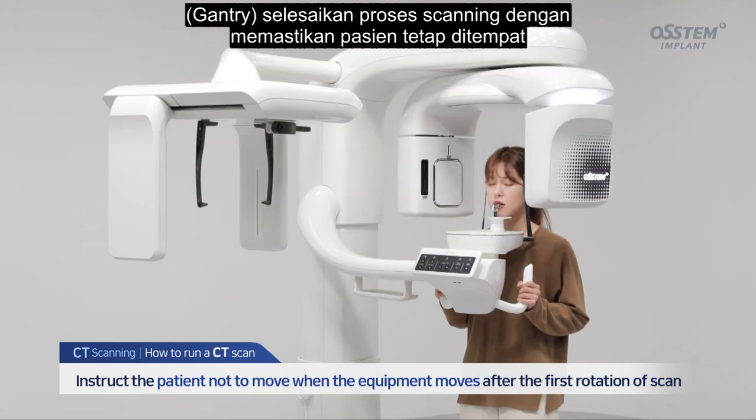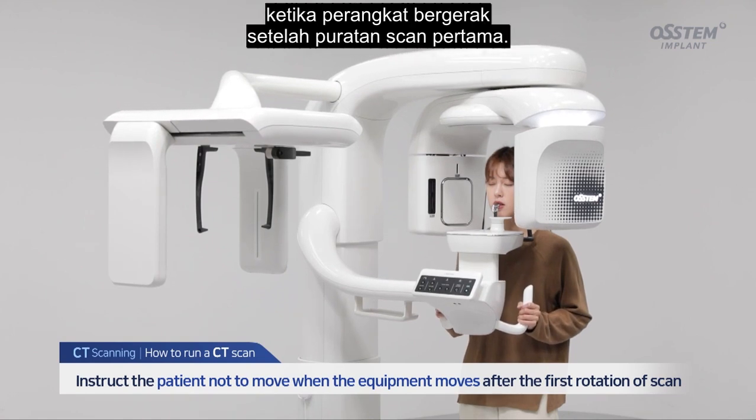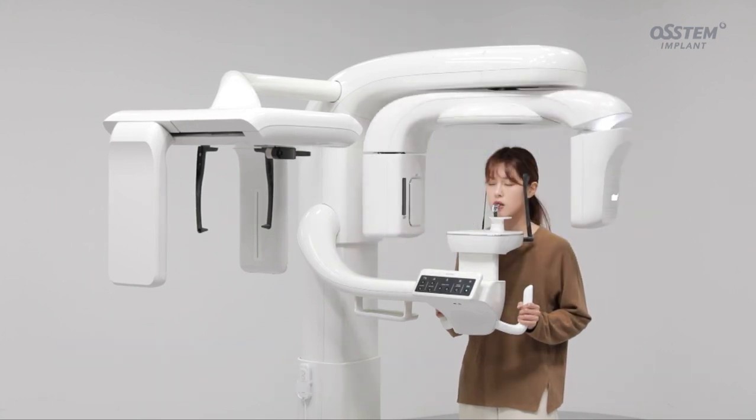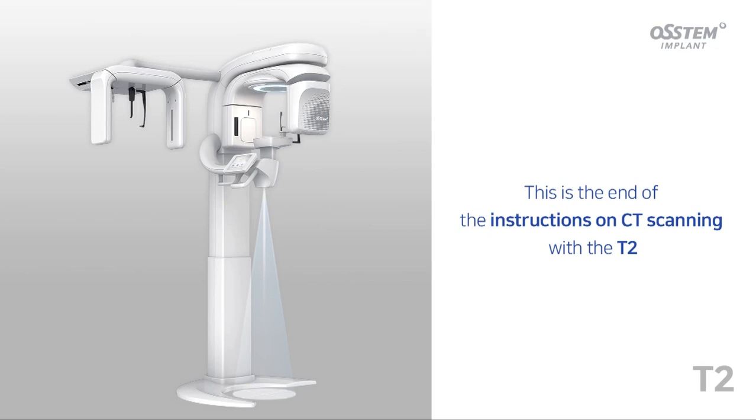The gantry completes the scanning process by ensuring that the patient remains still when the equipment moves after the first rotation of scan. This is the end of the instructions on CT scanning with the T2.